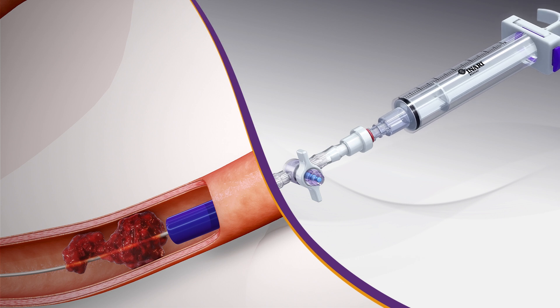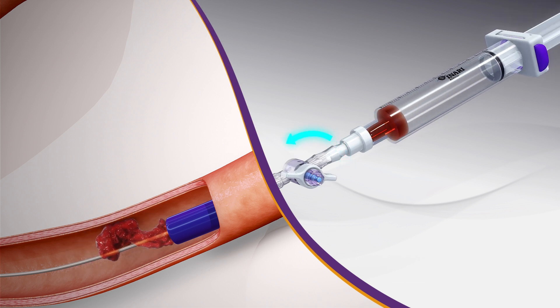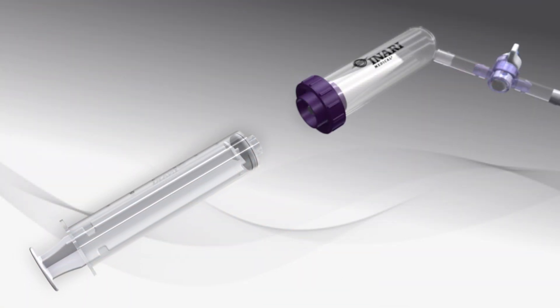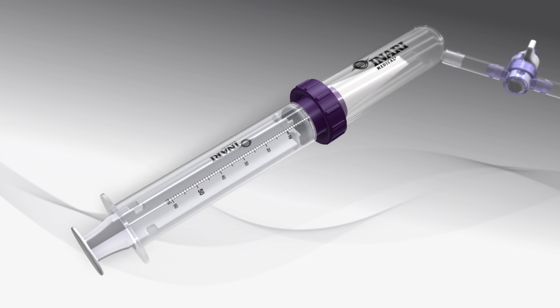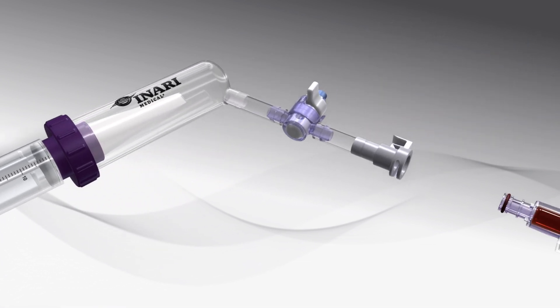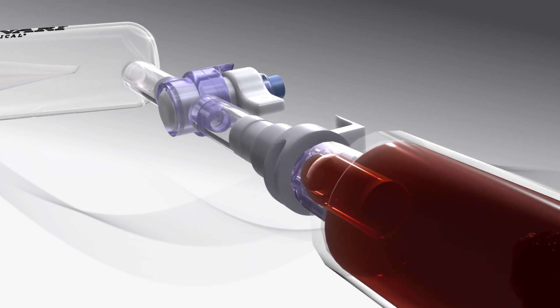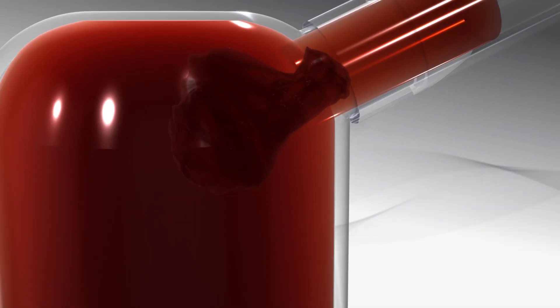The process for returning blood using the Flow Saver begins immediately after a whoosh aspiration. First, connect a standard-bore 60cc syringe to the bottom of the Flow Saver reservoir. Next, connect the large-bore syringe to the Flow Saver's side port and inject the contents to fill the 60cc syringe with filtered blood while keeping the Flow Saver upright.